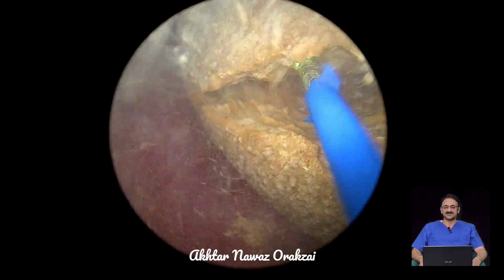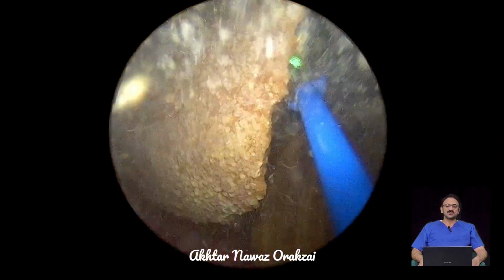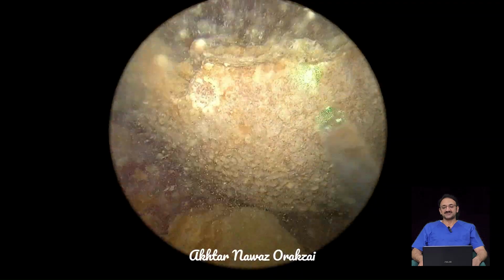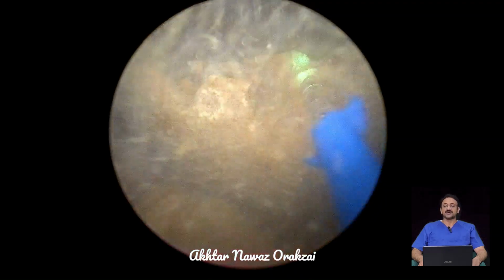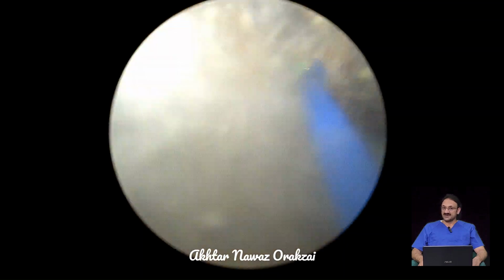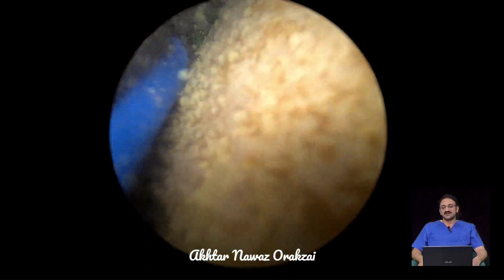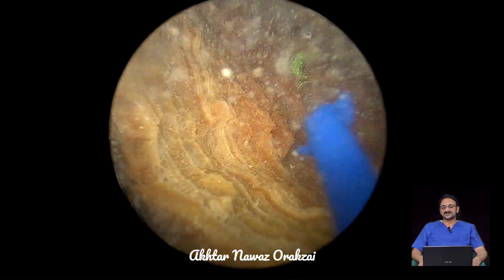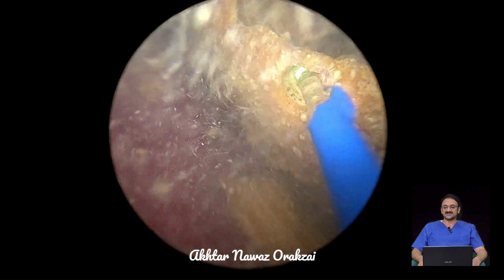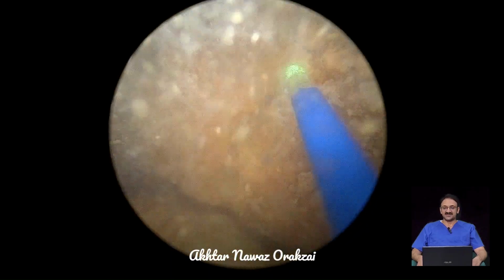And all of the stone was removed and cleared from the urinary bladder. As we all know, if the stone is very small, then the procedure for the obstructing prostate can be performed at the same time in the form of transurethral resection. However, if the stone is very large and it takes a lot of time, for example 40 to 50 minutes or 60 minutes or even more, then if you perform a transurethral resection of the prostate, that can lead to a higher incidence of urinary tract infections and infection of the raw surface. So it's better to perform these 2 procedures in 2 settings.